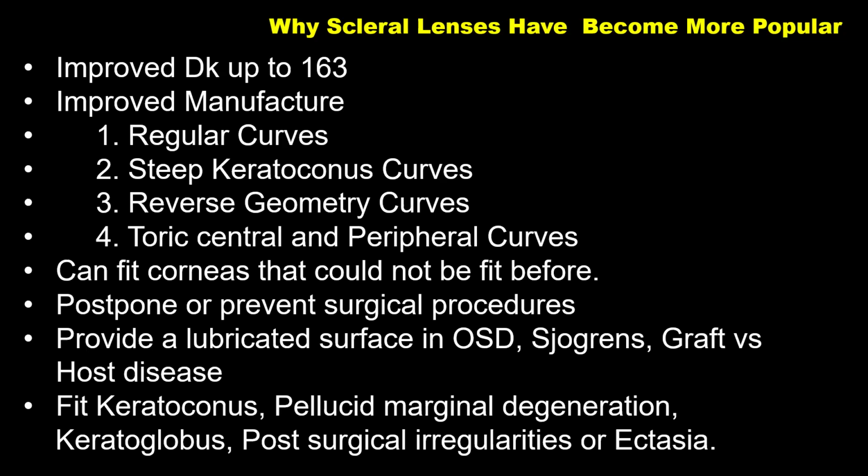So you have the cornea steeper at the center and flattening towards the periphery. Because this is a specialized contact lens, it is not something you get over the shelf. So the manufacturers can manufacture different contact lenses to suit different conditions and different needs of the eyes, which we shall see in the course of this presentation.